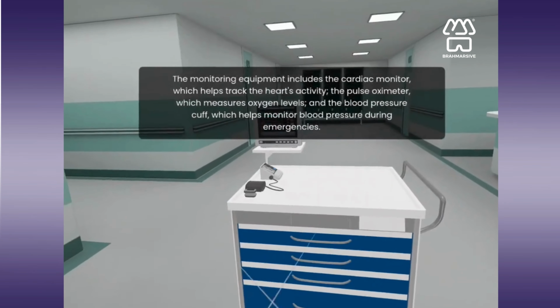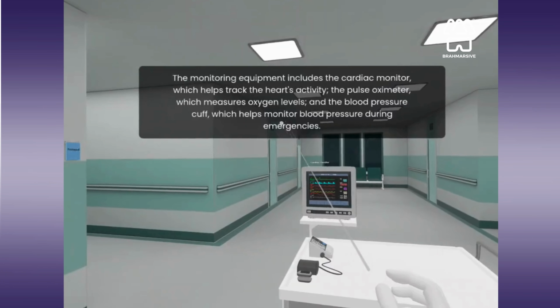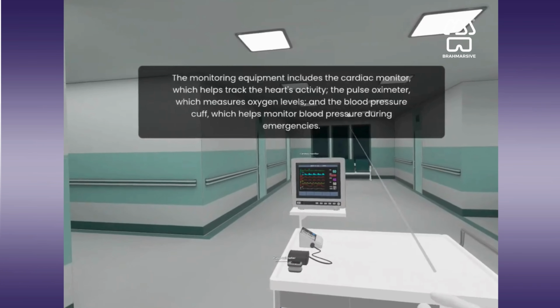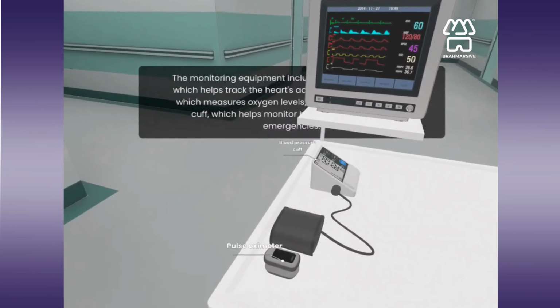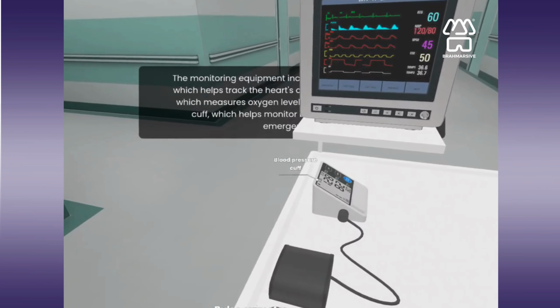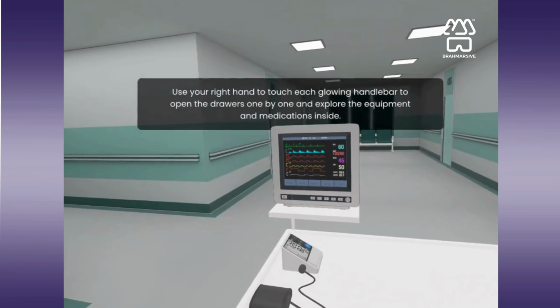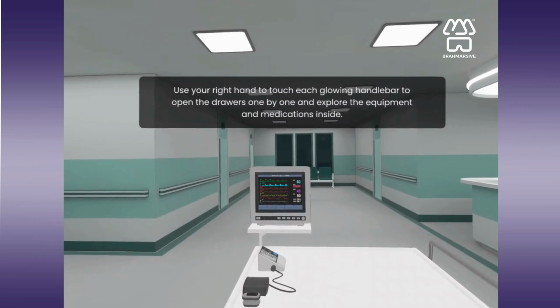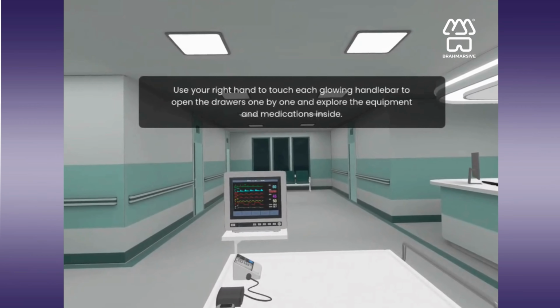The monitoring equipment includes the cardiac monitor, which helps track the heart's activity, the pulse oximeter, which measures oxygen levels, and the blood pressure cuff, which helps monitor blood pressure during emergencies. Now, use your right hand to touch each glowing handlebar to open the drawers one by one and explore the equipment and medications inside.